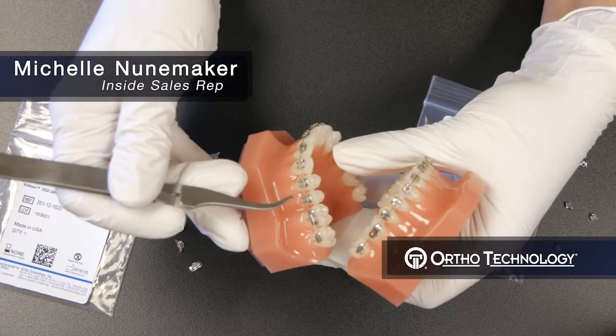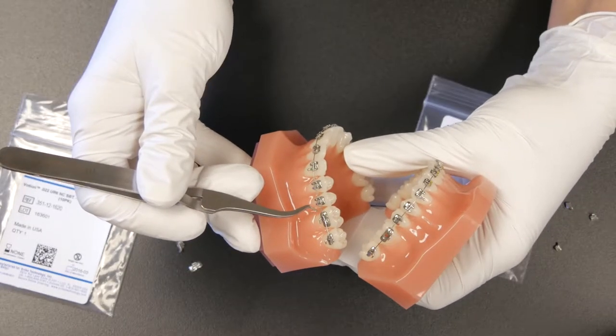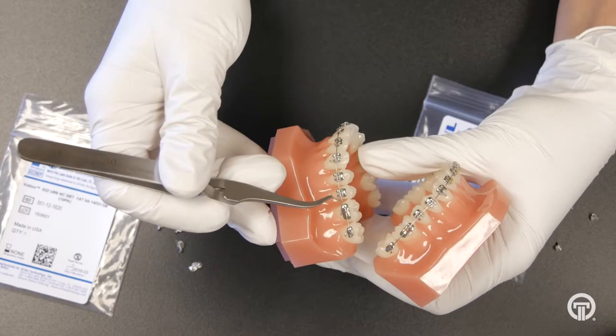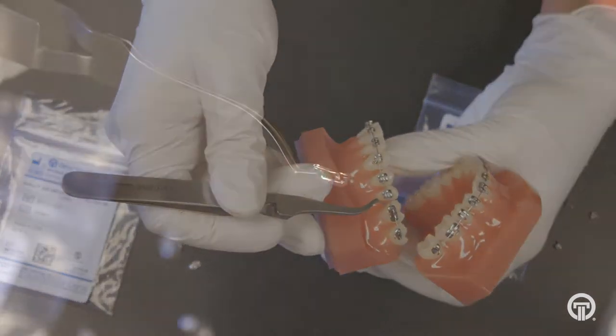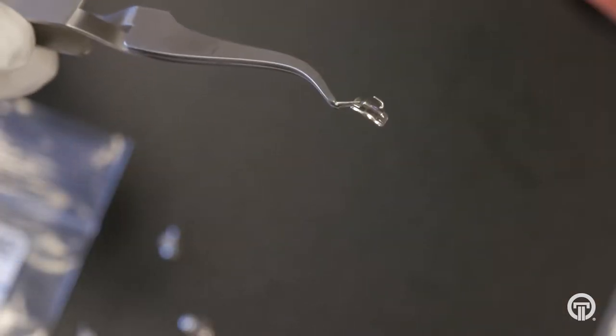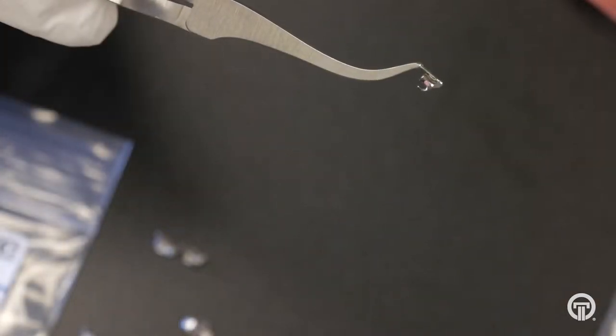Hi, my name is Michelle Nunamaker and I'm going to be speaking about the Votion Buckle Tubes. The Votion Buckle Tubes are very popular and they come in two different sizes: a standard size for the first molar and a mini or half tube for the second molar.